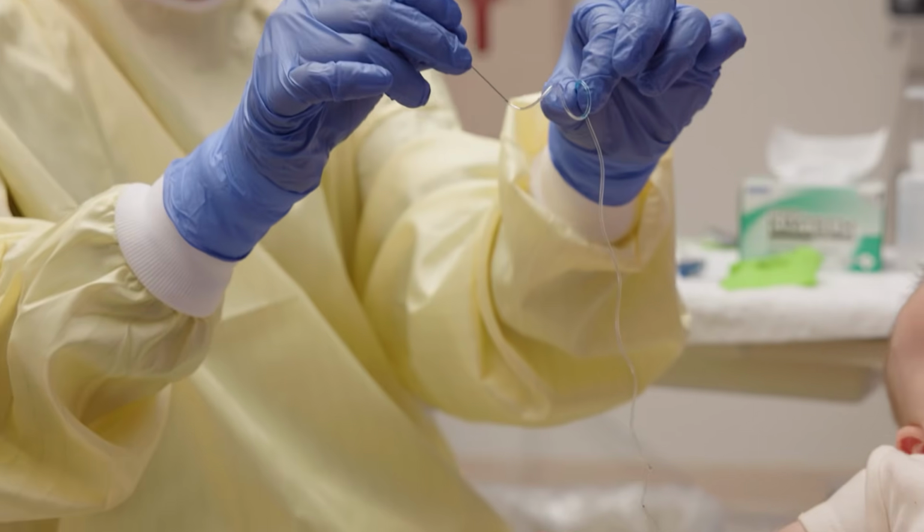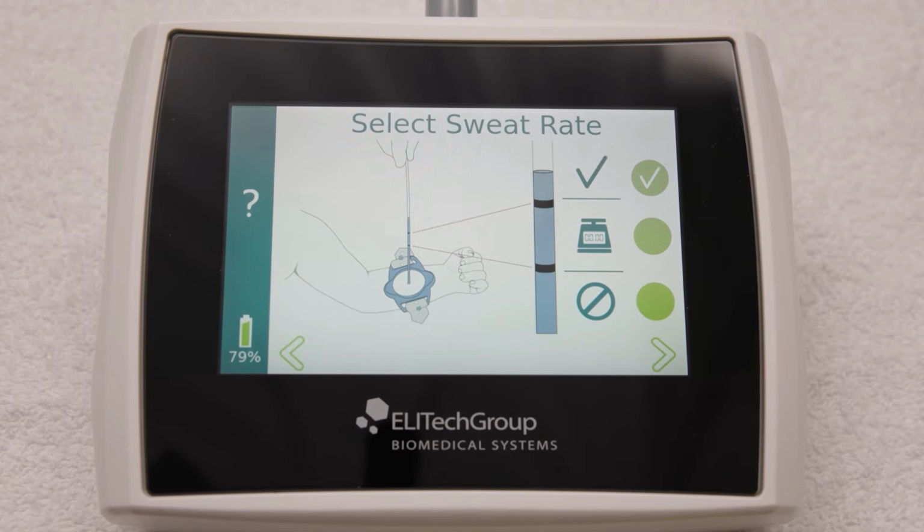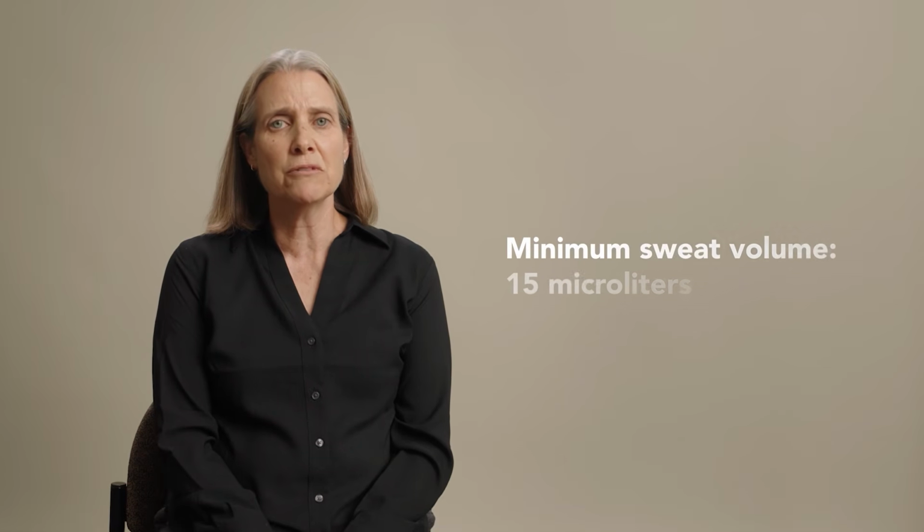With the tubing held upright, verify the sweat rate by checking the volume of sweat collected against the black indicator lines on the tube. Then tap the corresponding sweat rate on the touchscreen. The minimum sweat volume is 15 microliters per specimen, and adequate collections are also indicated by black lines on the coil. We recommend sending all specimens to the laboratory for volume assessment.